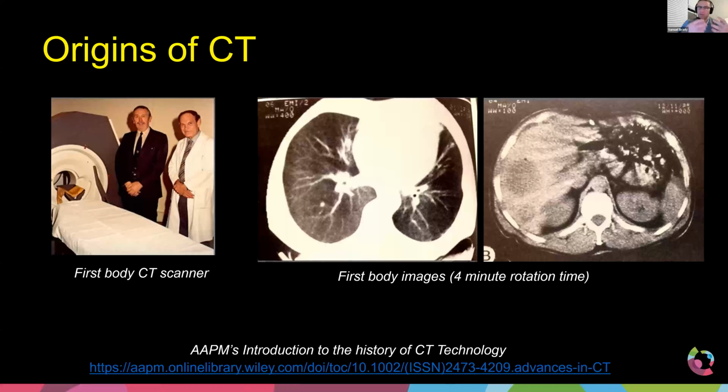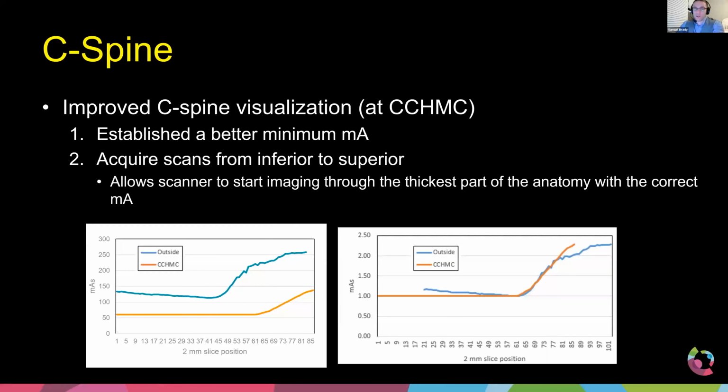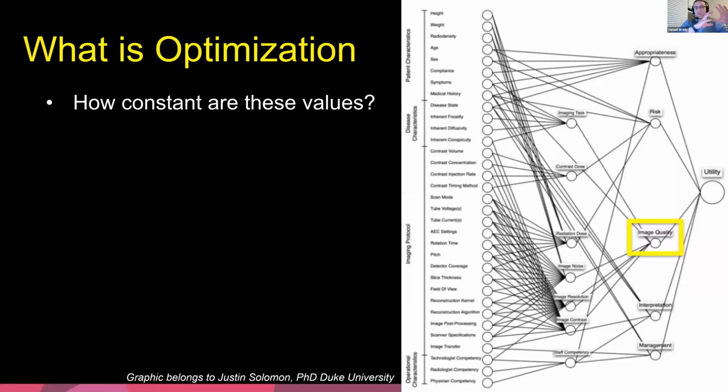But as we go forward, about every 5 years, CT technology makes a really big step forward. And so I'm not saying that we always need to buy a new scanner every 5 years, but I'm just saying that as we try to stay on the front of that technology wave, we have the ability to really harness a lot of the good image quality we have now in the low doses. And I showed you a lot of those pie charts last week about how, at least in the US, most of our doses in over a 10-year span have come down, even though utilization for the CT scans for the chest, head, all aspects of the body have gone up. And that's just mostly because technology has been improved and we have been able to harness that technology.